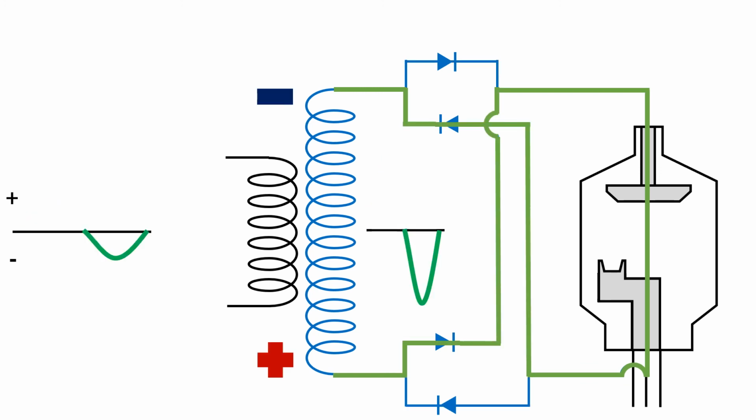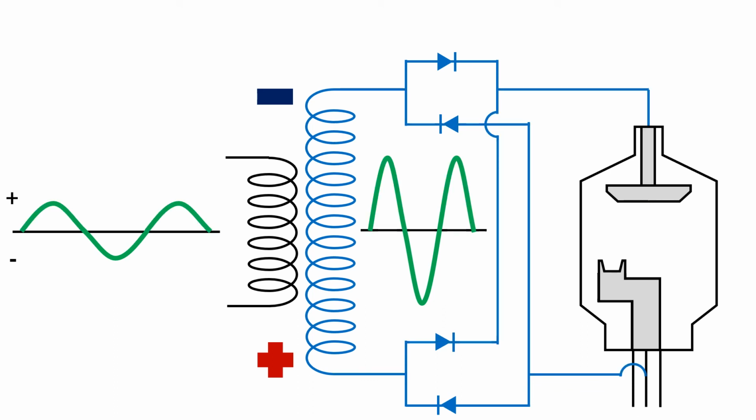And because electrons completed their journey from negative to positive when we flip the polarity, it's also represented on the graph like this. Altogether, the graph of a full wave rectifier looks like this. Now our X-ray machines are using all of the electrons.